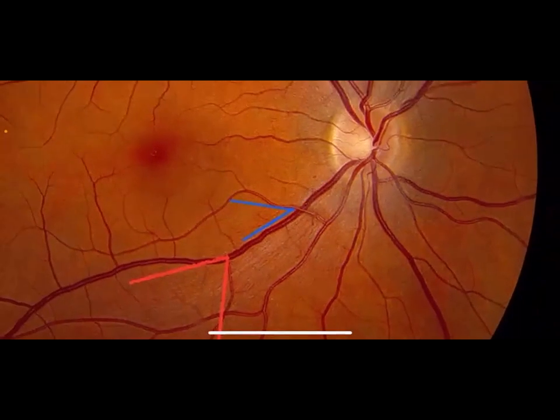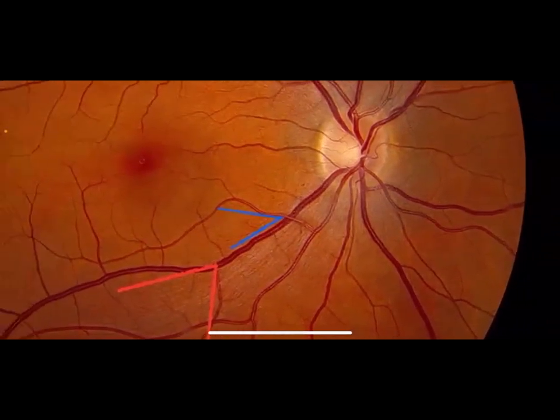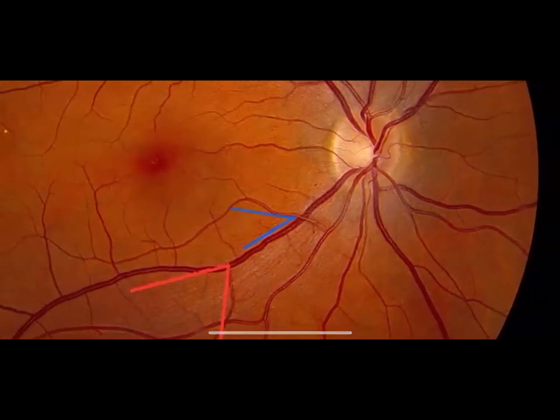Suddenly you will see something shiny. Make sure that this is the optic disc. Now you have arrived safely at the optic disc. What to see in the optic disc? The normal shape of the optic disc: usually the optic disc medially, or on the nasal side, the border will not be clear and sharp compared to the lateral or temporal side.